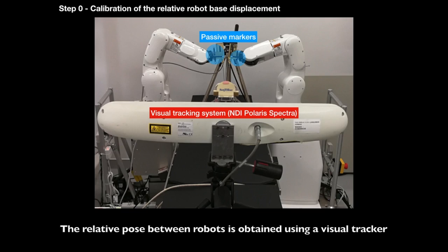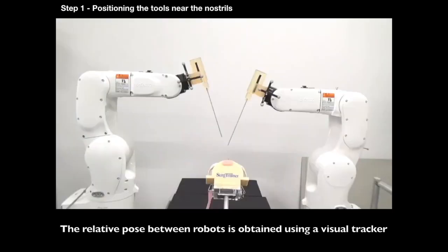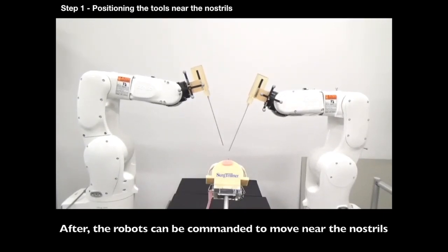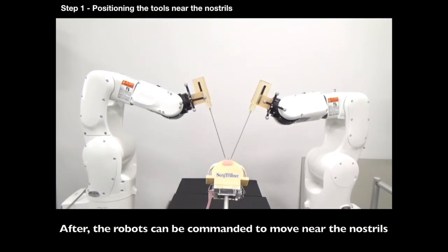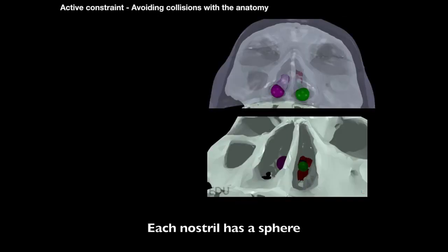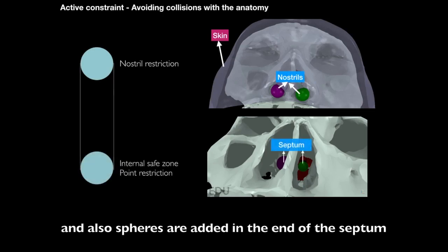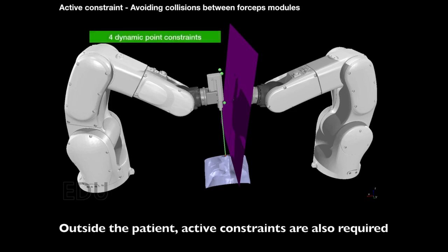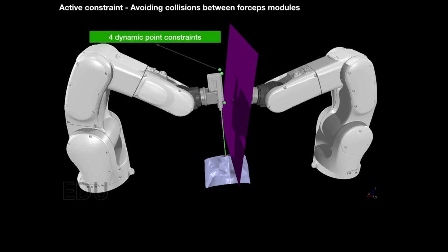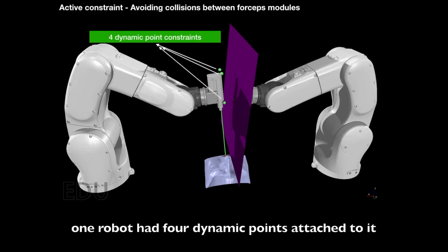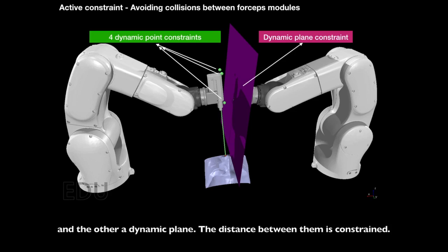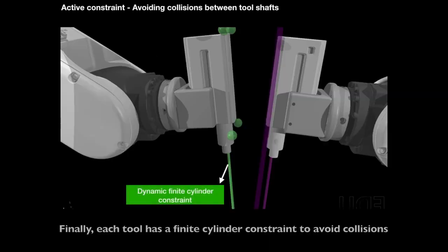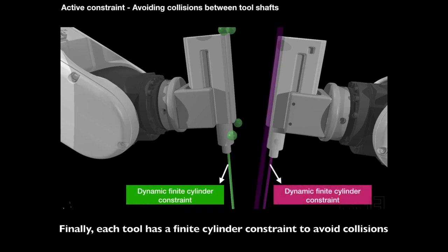Experiment B: Constrained workspace manipulation. The relative pose between robots is obtained using a visual tracker. After, the robots can be commanded to move near the nostrils. Each nostril has a sphere, and also spheres are added at the end of the septum, whose distance to the tool centerline is limited. Outside the patient, active constraints are also required. One robot had four dynamic points attached to it, and the other a dynamic plane. The distance between them is constrained.